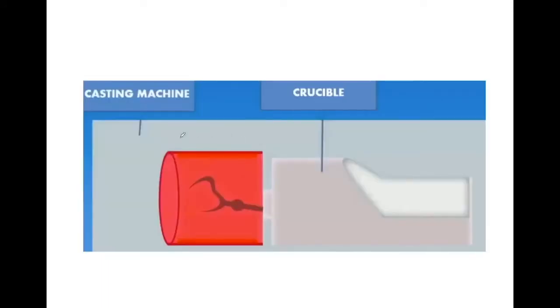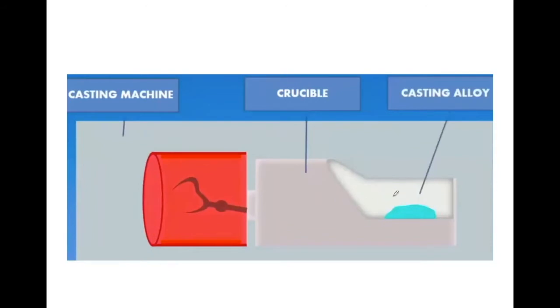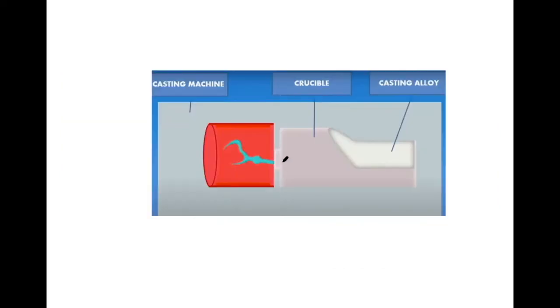This is the casting machine in which we place our mold — it is attached to the crucible. In this crucible, we place the gold alloy, which is the casting alloy. It is heated until it becomes bright orange in color and shiny in appearance. Once this alloy gets heated, we rotate the casting machine and due to centrifugal force, this molten alloy flows into the sprue former and then into the empty mold which is formed by the lost wax technique. You can see this alloy which was present here — when melted with heat, it flows and fills the mold space.